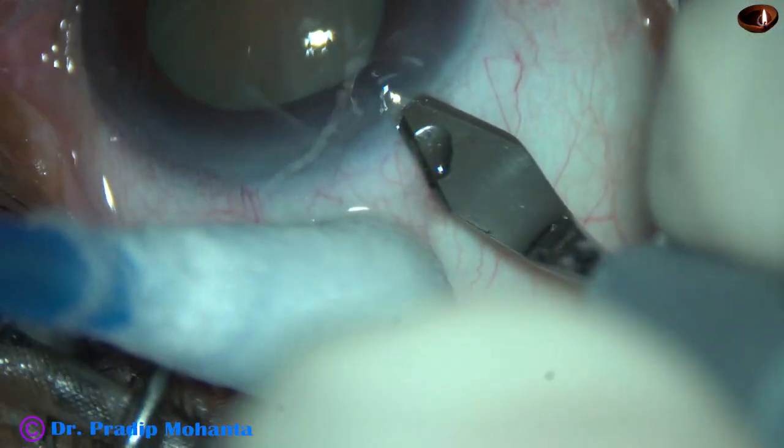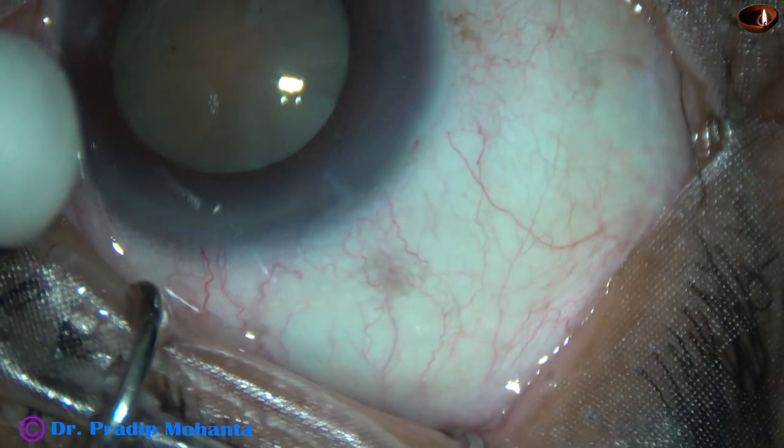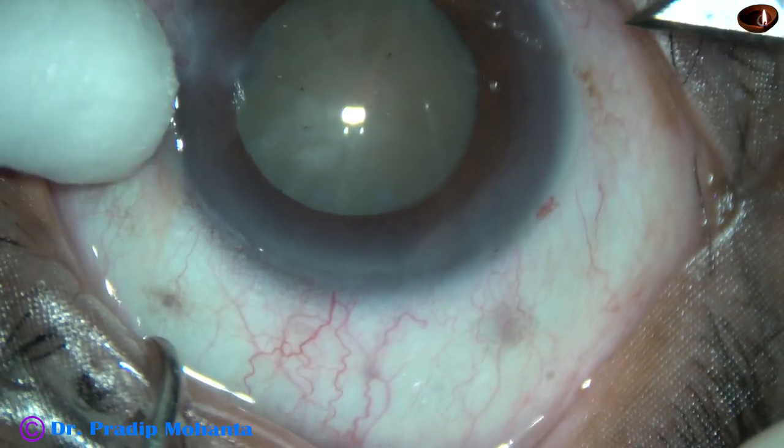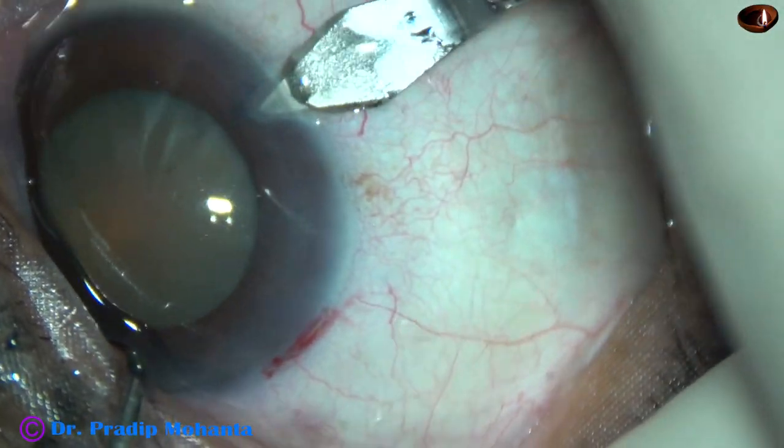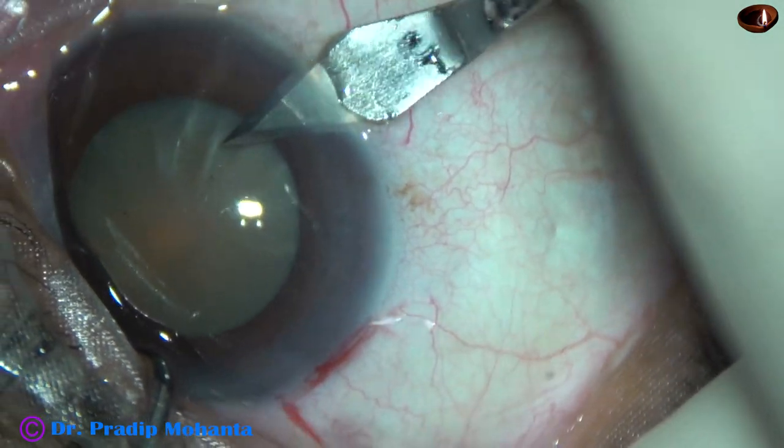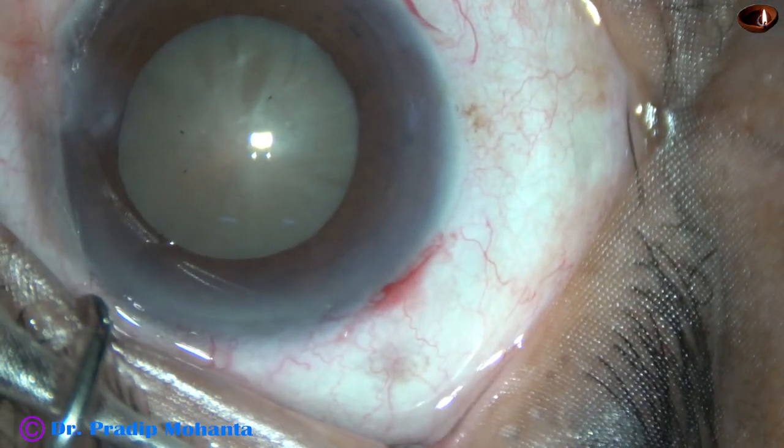This is the main incision with a 2.8 mm steel keratome at around 11 o'clock on the posterior aspect of the limbus. This is a side port on the right side of the main incision with the keratome itself.